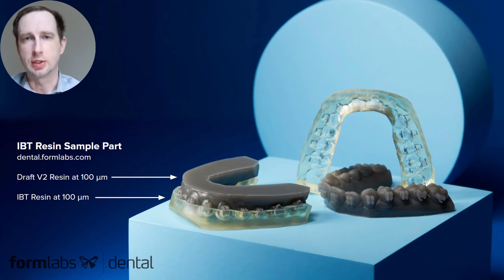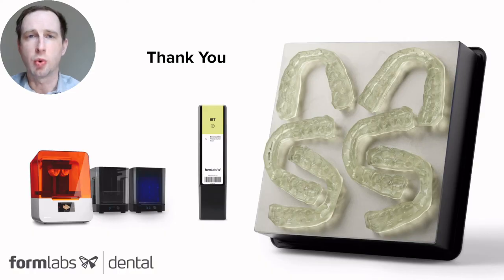The sample actually consists of two parts: a model printed in Draft Resin at 100 microns, and then the appliance printed in IBT Resin at 100 microns as well. Although these workflows are done completely model-less usually, we wanted to include the model with the brackets built in so anybody can see how the brackets fit to the pockets, and also how the appliance goes on across arch. I hope you've enjoyed this quick overview and it's given you a little bit more information. Thank you for your time. My name is Sam Wainwright. Have a great day.